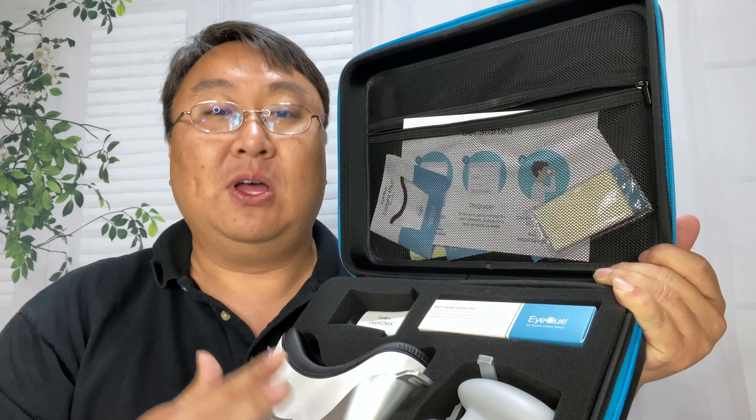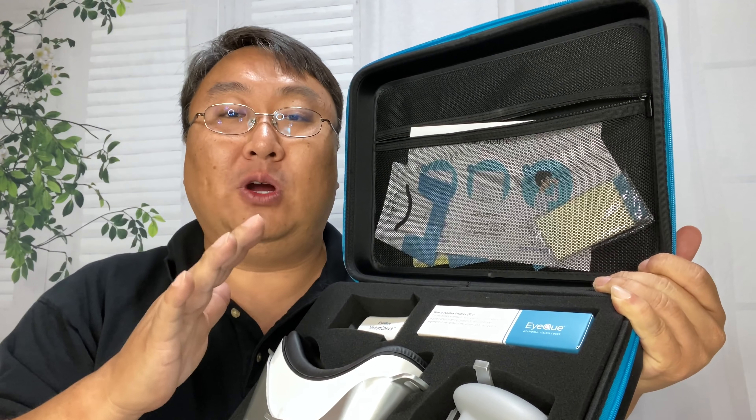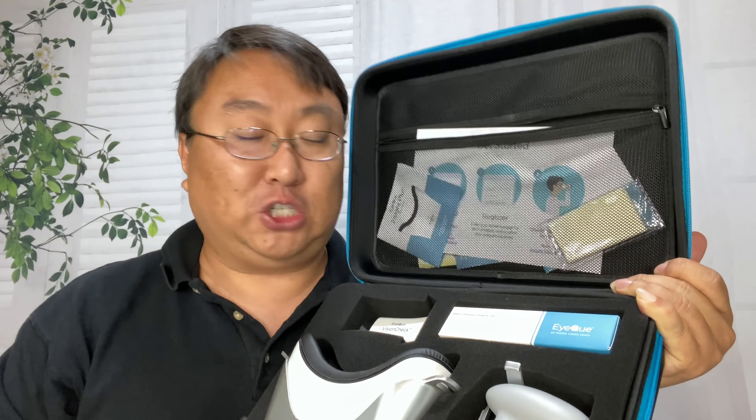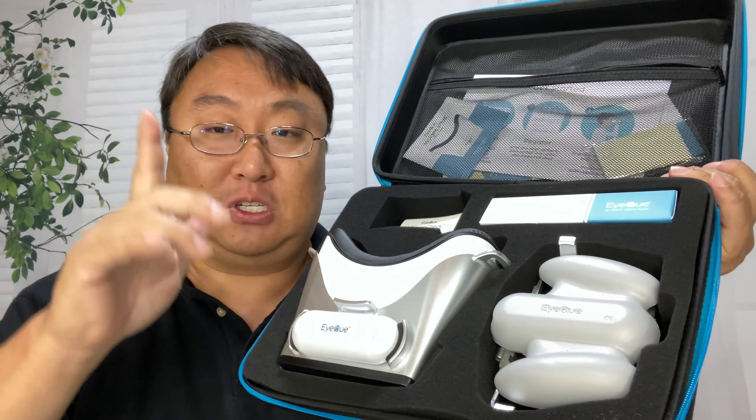It does come with instructions, but I'll also say that on the EyeQue YouTube channel they have a lot of instructional videos on how to use these devices. I'm going to leave the details up to them, but I'm going to give you a little crash course on how you can use these to get a pair of glasses for yourself.